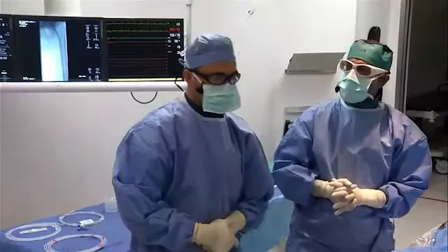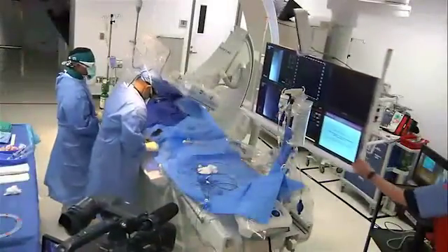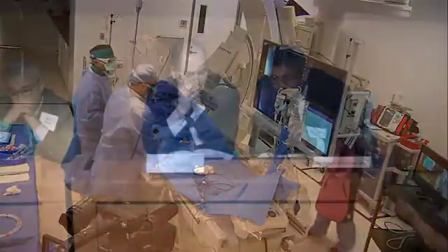So Mehdi, you have already... Mehdi, can you hear us? Yes, please go ahead. What I'm saying is that you already have a retrograde sheath from the other side, so it means you're going to go endovascular. But given that we had a very nice discussion about approaches and strategies to deal with these cases where there's also an AV fistula, which I believe is spontaneous or traumatic, did you previously attempt this case? Because it is highly unusual to have such an extensive fistula.